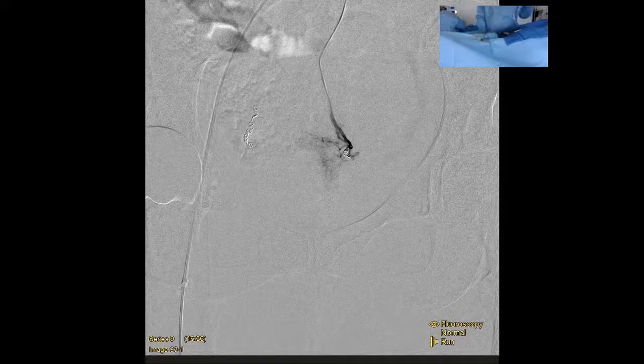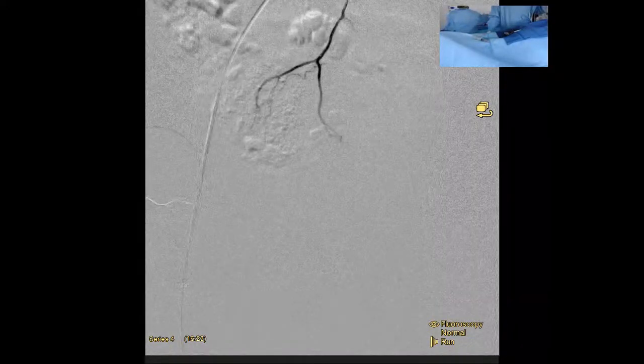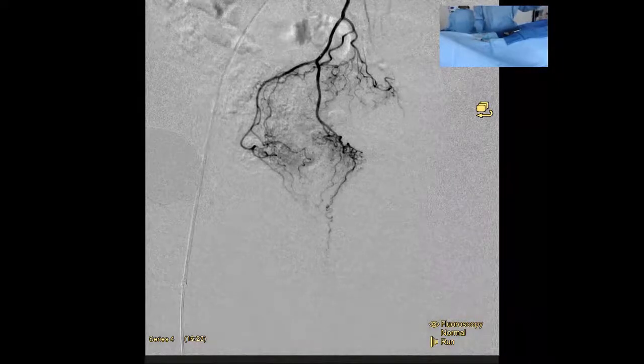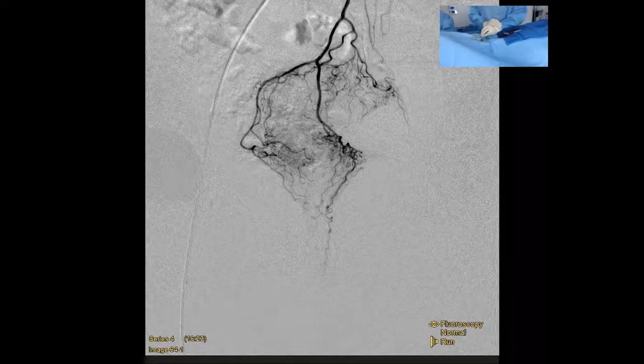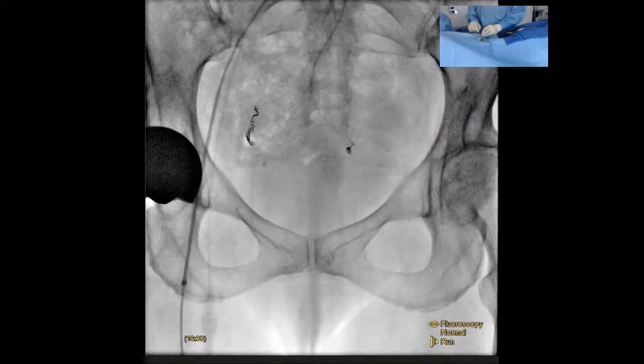So following this, let's go back and review our previous imaging here. We were right at the bifurcation. When we look at this, it looks like we've gotten the dominant two vessels that are supplying us. Are there some other small branches? This comes up all the time. Should you try and chase down these other tiny branches that are more in the central portion of the rectum, if you will, not on the lateral walls? If they were larger than this, or there was flow down to the cushion, absolutely. But in someone like her, it's not. You're more likely to cause harm and perforations by going after those than you are otherwise. In some other cases where the arteries are much larger, absolutely.